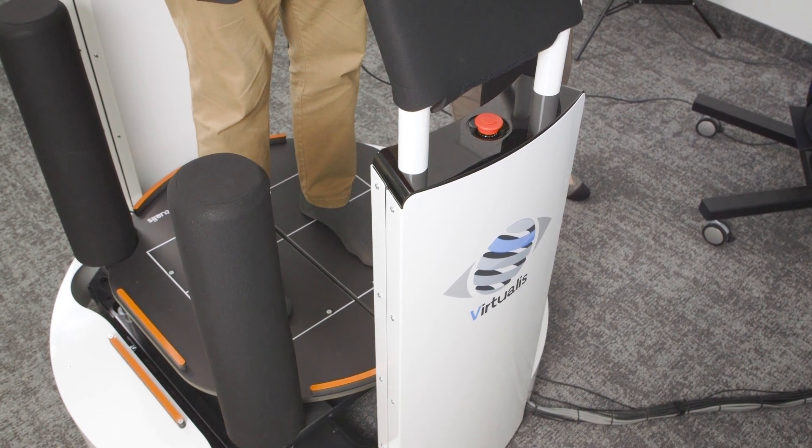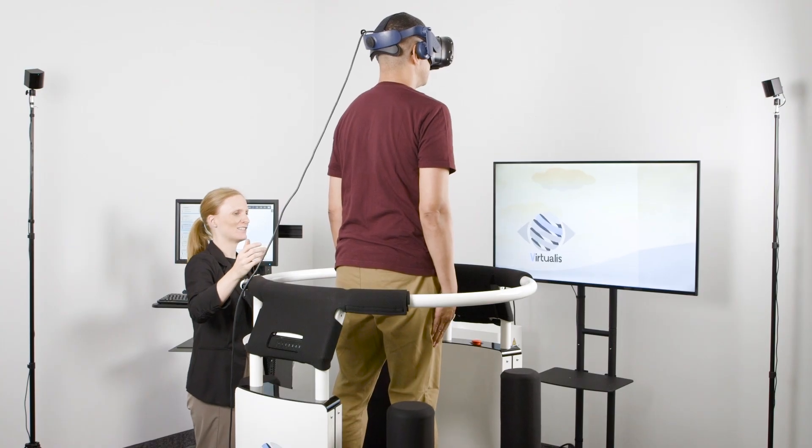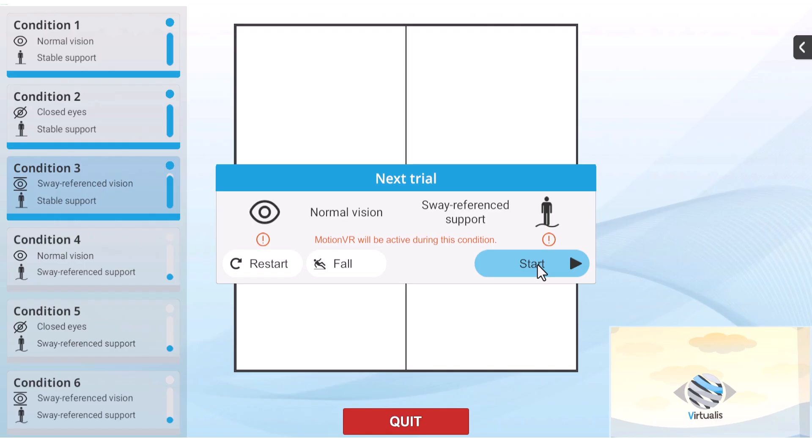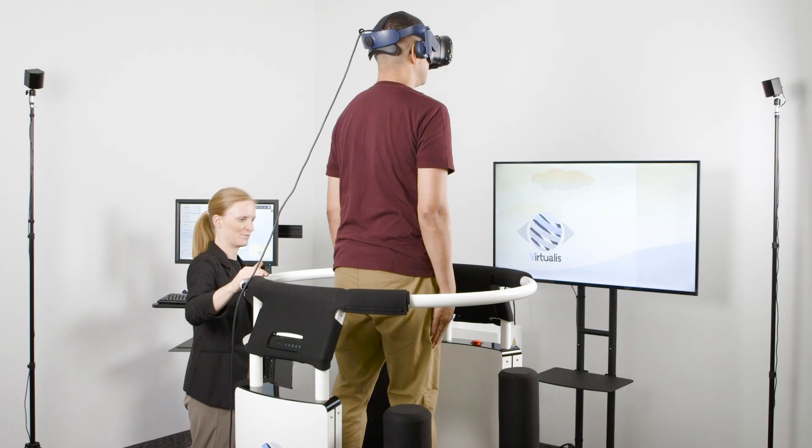It's important to leave time for the patient to adapt to the unstable surface before beginning condition four. When ready, begin condition four, which is eyes open on an unstable surface.